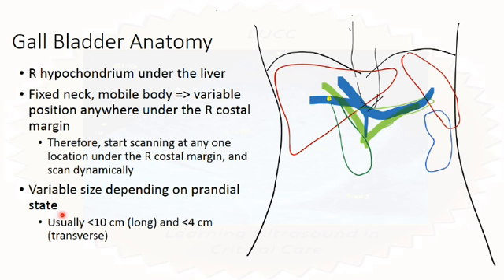And therefore there's no real value to looking at the size of the gallbladder. So there's no point saying the gallbladder is large or the gallbladder is small. But one condition: it's unusual to have a gallbladder that's more than 10 centimeters long and more than 4 centimeters in the transverse. So if it's a huge gallbladder like this, then perhaps in the appropriate clinical setting, you may think of cholecystitis or a distended gallbladder. Okay, right. Now, that's the gallbladder there, they're tracing beautifully.